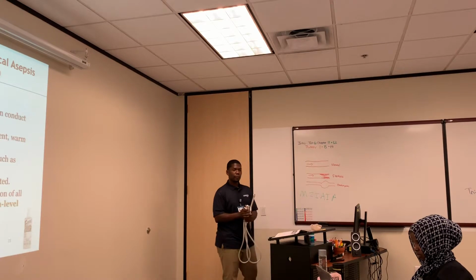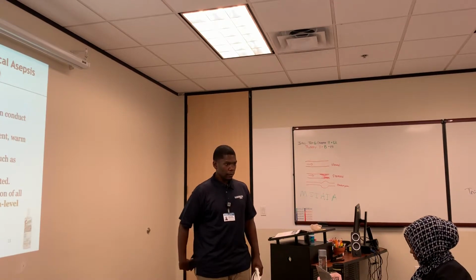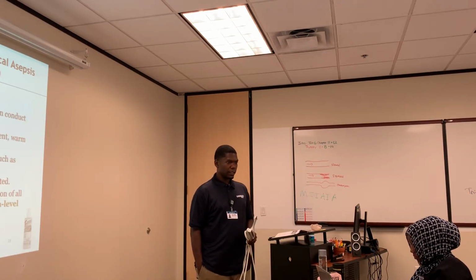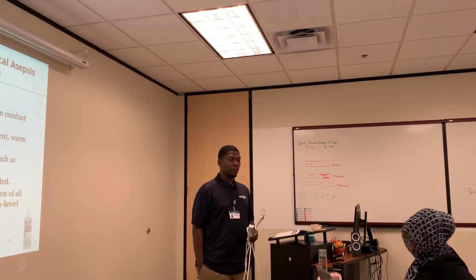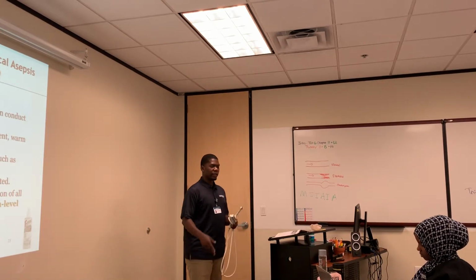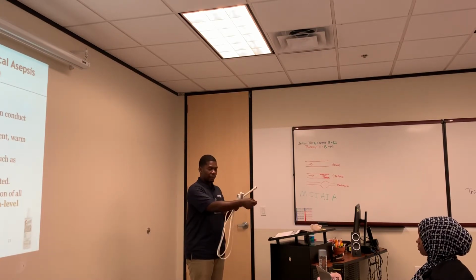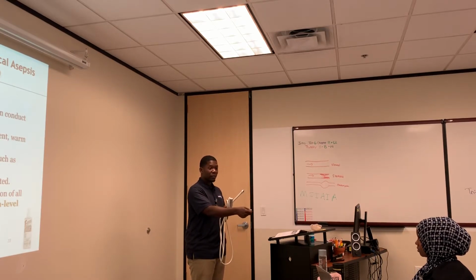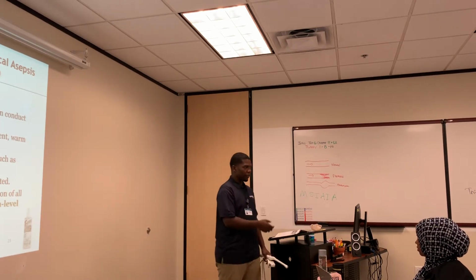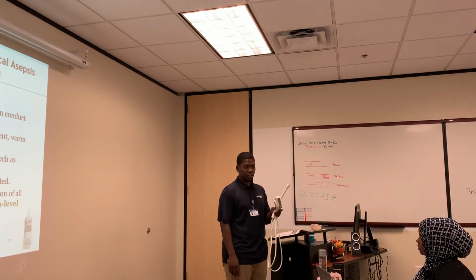Excuse me? Yes, ma'am. If we want to sterilize the equipment, is it all the same for all the patients? Yeah, you're going to sterilize all the transvaginal, endovaginal, transrectal, and esophageal probes the same way. Even if I had a probe that I did a translabial with, right? Everybody know what a translabial is? Say for instance, a woman has a mass on her vagina, on the labia, the lips of the vagina. Sometimes you have to do an ultrasound right there. Translabial ultrasound. I know it sounds really invasive. I can't use a transvaginal on that. I'm going to use a 12 transducer, because I need that to be superficial. So after that, I can sterilize that same 12 transducer the same way.